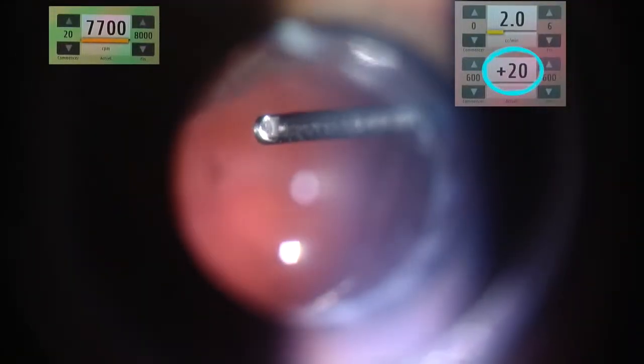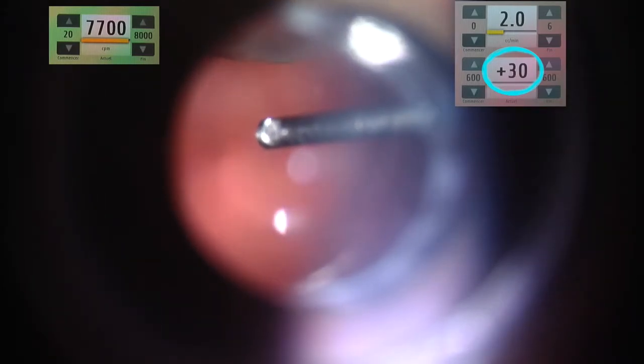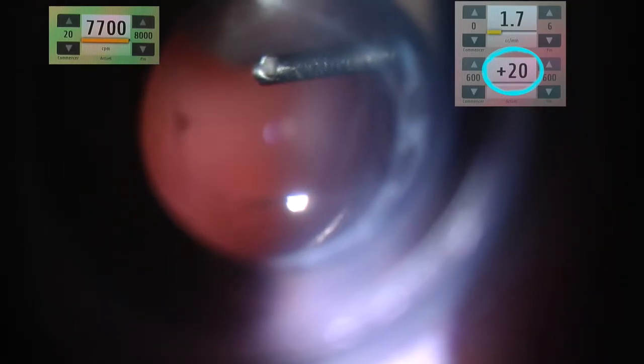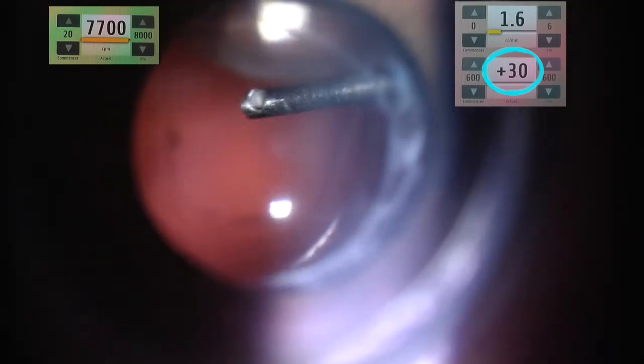We can see it clearly here on this example where in 23 gauge at 8,000 cuts per minute, the pump remains in positive pressure between plus 20 and plus 30 millimeters of mercury, simply because no vitreous is sucked in. Proof can be given in this example where, as long as I cut at high speed, the hemorrhagic vitreous at the base does not come into the port, and as soon as the frequency drops, it rushes in.